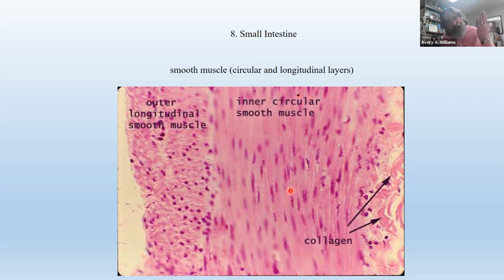Now, if you're taking a cross section through the organ here, the hollow organ, you can see this. And of course, this is like a lateral view looking at the sides of the smooth muscle cells. And this is beautiful because you can see the nuclei, the sides of the nuclei, and the long, kind of stretched out nuclei, the long tapering cells, very characteristic of smooth muscle.